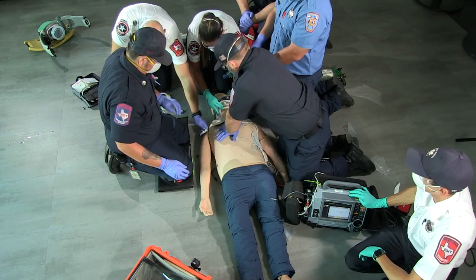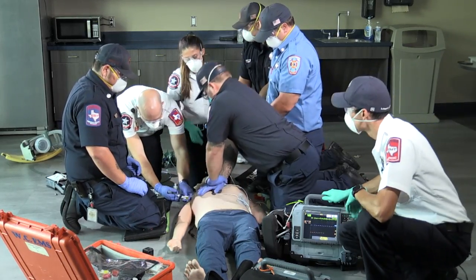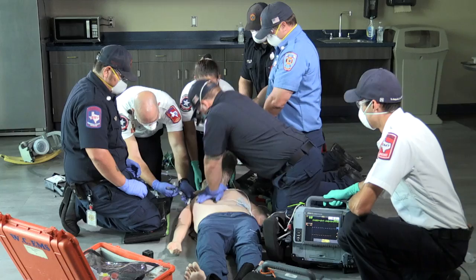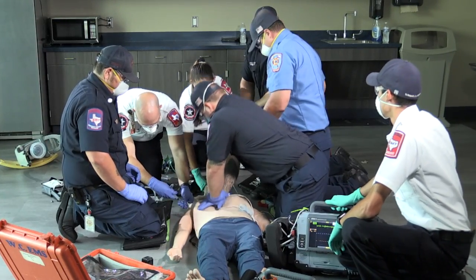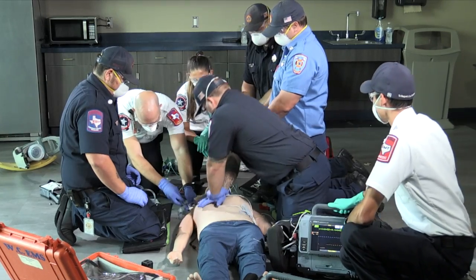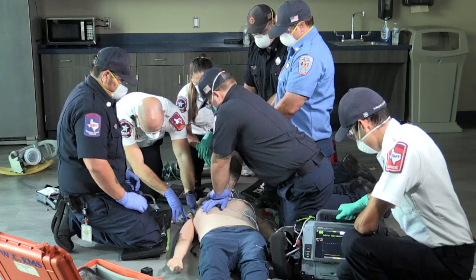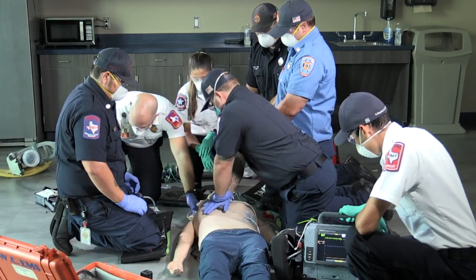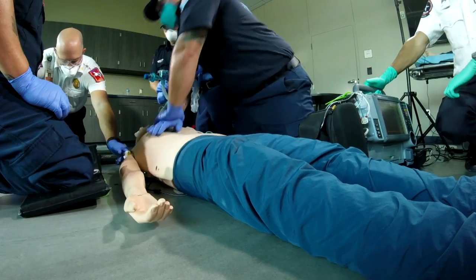Go ahead and get that 150 milligrams. Alright. 150 going in. Alright. 150 amiodarone is in. Thank you. We still have good end-tidal CO2. We're secured. Alright. Good.